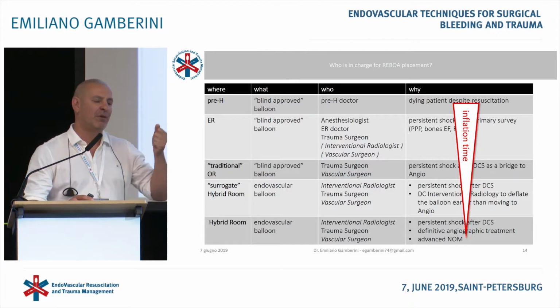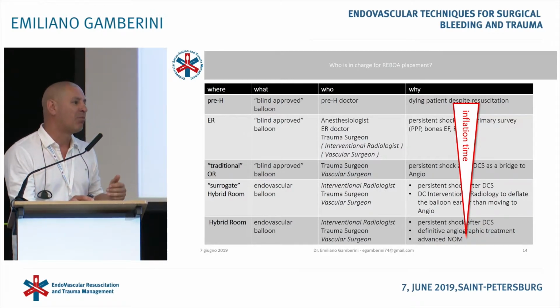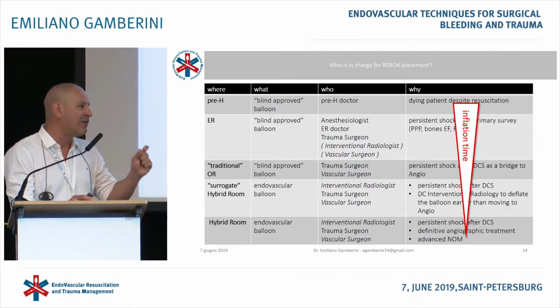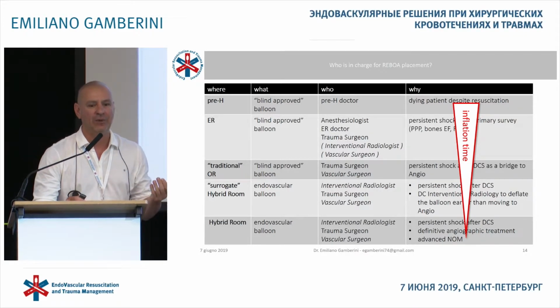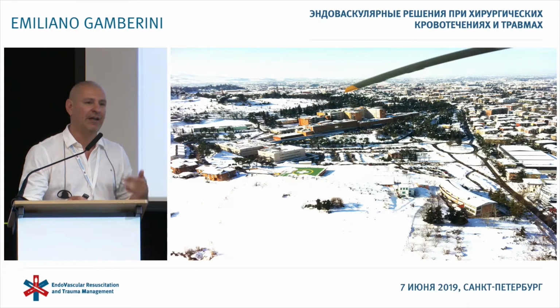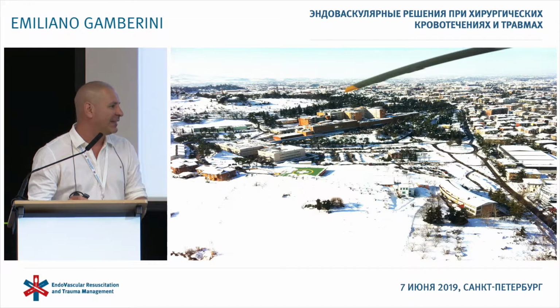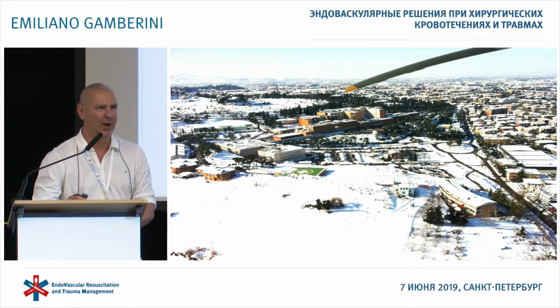Time decreases dramatically going down in these tables, and probably in a hybrid room, REBOA inflation is very reduced as an indication. So what we really need is setting-based protocols. My conclusion is with a very uncommon picture of my hospital, a seaside hospital, and this was all covered by snow in 2012. Thank you very much.